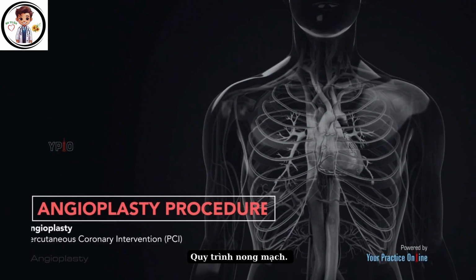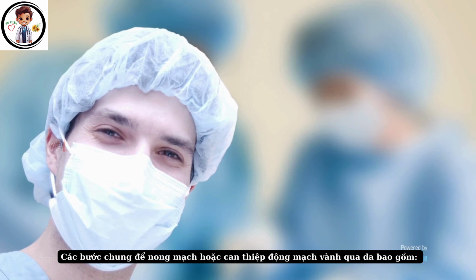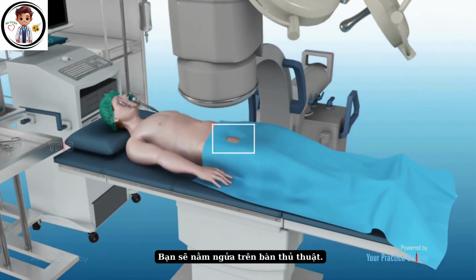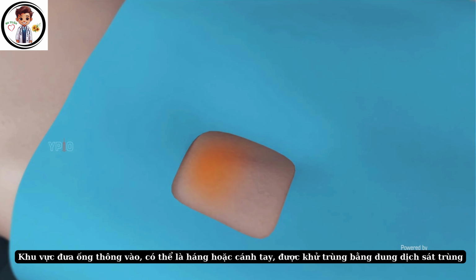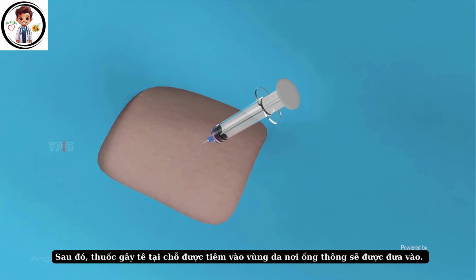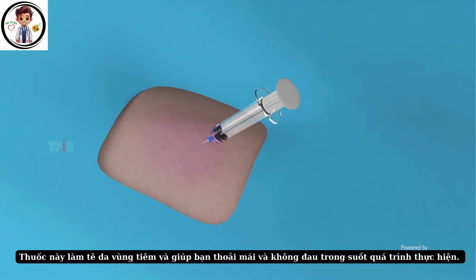Angioplasty procedure. The general steps for angioplasty or percutaneous coronary intervention include: you will lie on your back on the procedure table. The insertion area, either the groin or the arm, is sterilized with an antiseptic solution. Then a local anesthetic is injected into the skin where the catheter is to be inserted. This numbs your skin and keeps you comfortable and pain-free during the procedure.